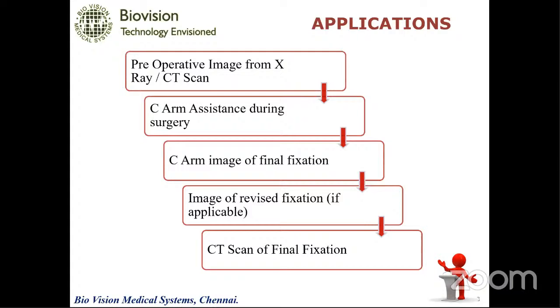But taking a laptop and a cassette to the operation theater may not be advisable, because how will you sterilize that? How will it be autoclaved? These are shortcomings of X-ray radiography, especially digital radiography. So for these purposes, we can go with C-arm during surgery. So during surgery, I say that I'm going to implant in this particular place. How do I know that I'm implanting only there?